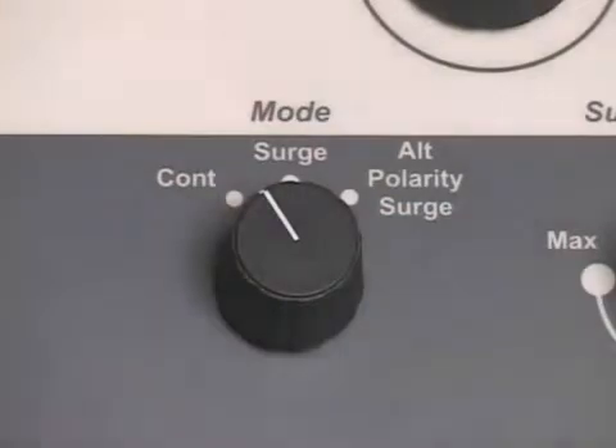Set the output mode control to continuous. The LVG325A intensity level should always be set while the device is in the continuous mode. This will prevent unexpected surges of intensity during the initial patient setup in surge or alternating polarity surge modes.